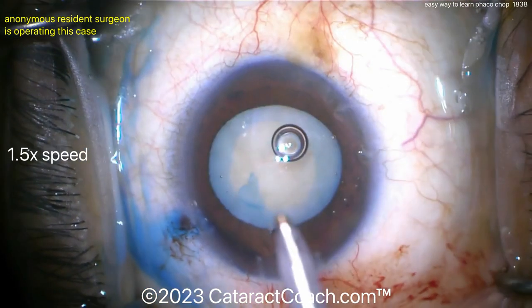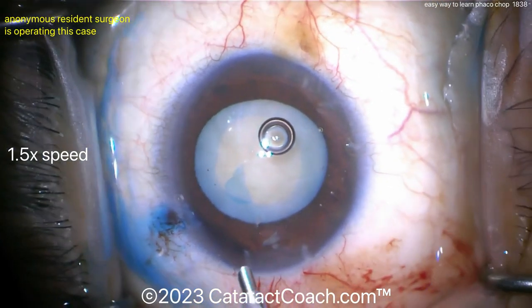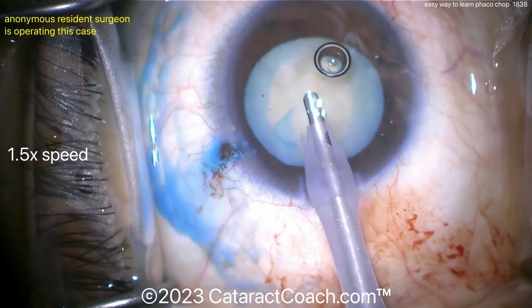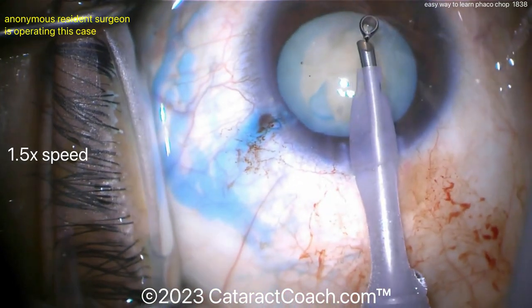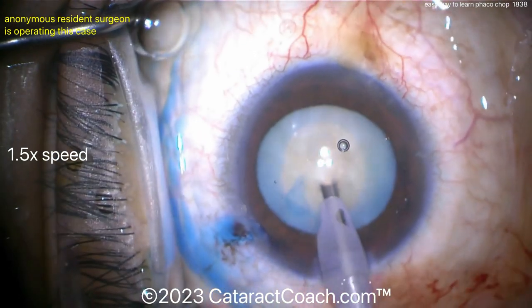Here's a resident case — a white cataract. You can see it's a little bit of a small rhexis, so that's going to be a challenge. The rhexis is probably less than 5 millimeters, maybe 4.6 to 4.8, somewhere in that range. You've got to get that phaco tubing out of the view as well — you can't have that phaco tubing coming into your view.